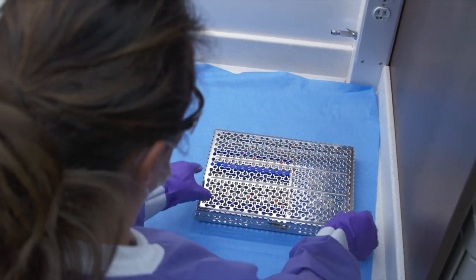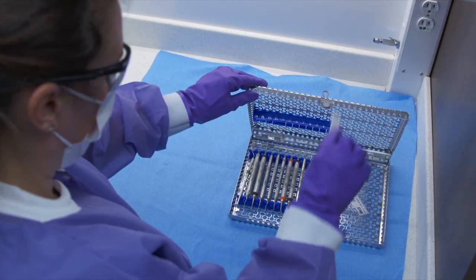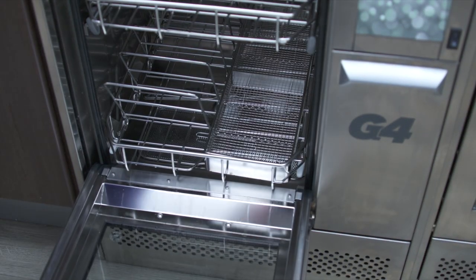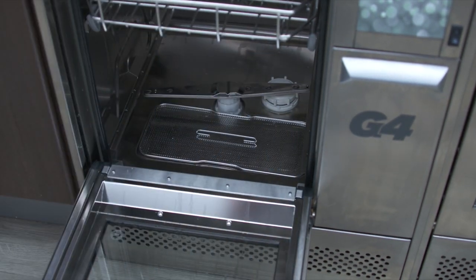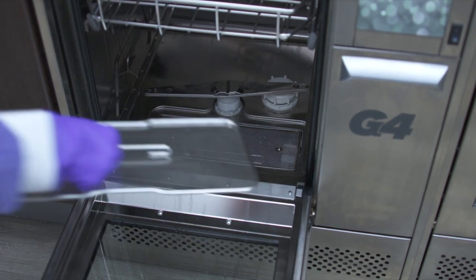The instruments are now washed successfully and ready to be pouched or wrapped for sterilization in Statim, StatClave, or Bravo. Doing simple daily checks will make sure your Hydrum is always running smoothly. Review the operator's manual to get step-by-step instructions for these checks.